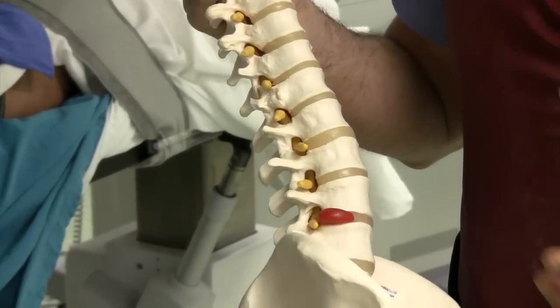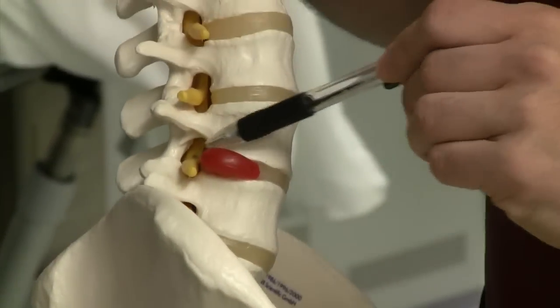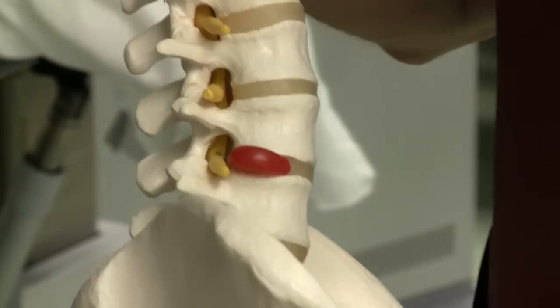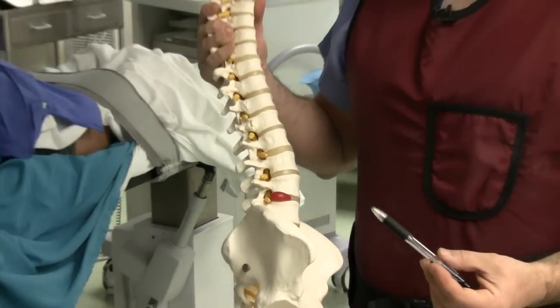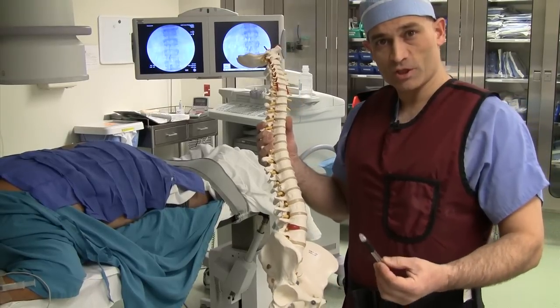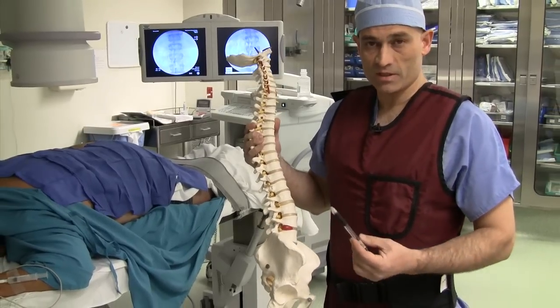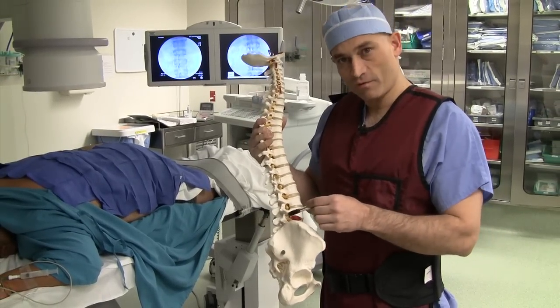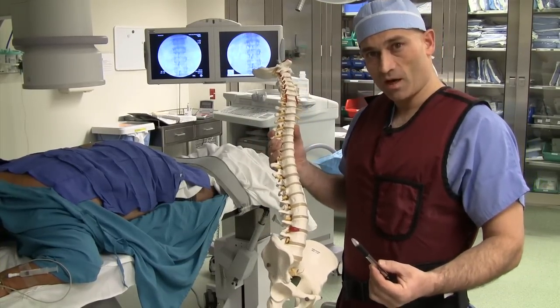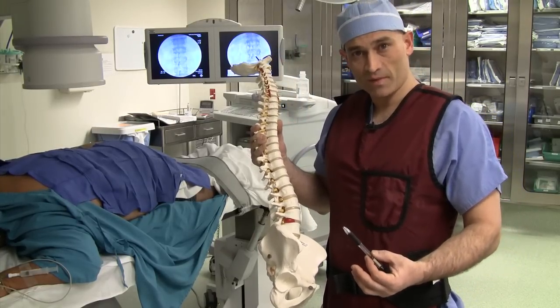And the reason that people with herniated discs can sometimes experience leg symptoms is because the herniation presses upon the nerve root, leading to complaints like pain, numbness, tingling, and even sometimes weakness of the leg. And what the transforaminal epidural injection allows us to do is to deposit medicine, an anti-inflammatory and some local anesthetic, into the neuroforaminal space. We carry out this procedure with the use of fluoroscopic guidance, which assists in the safe and effective placement of the medicine.